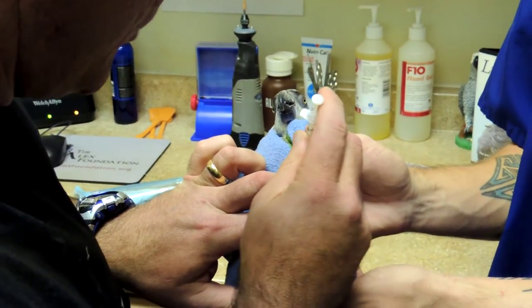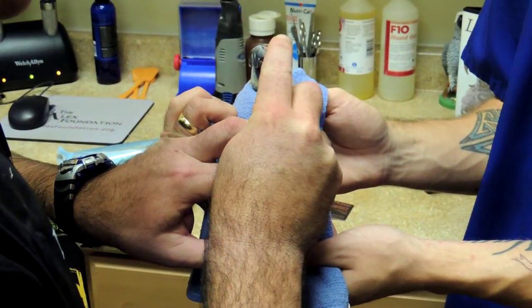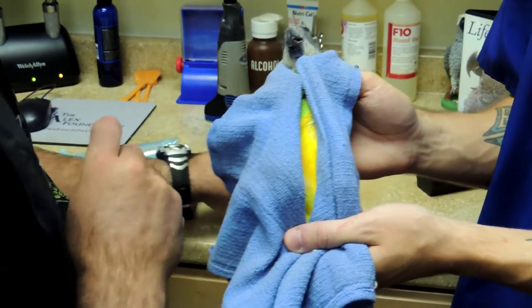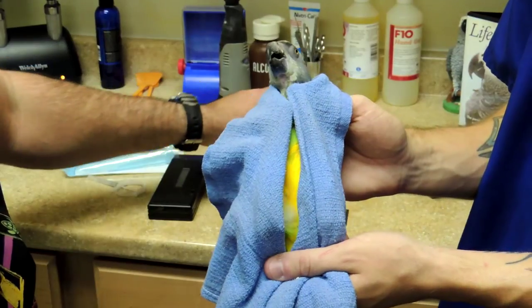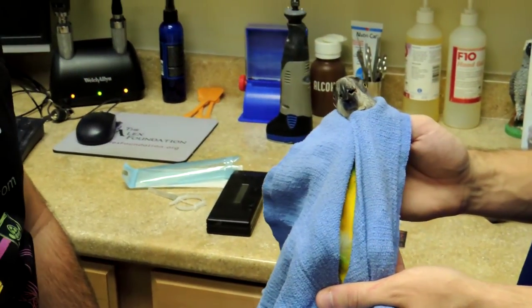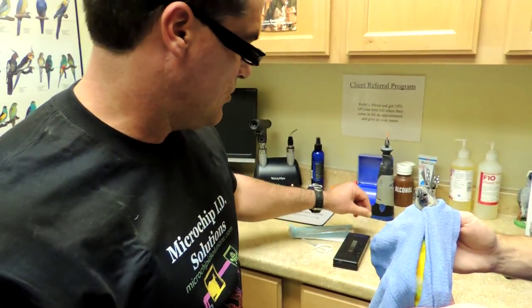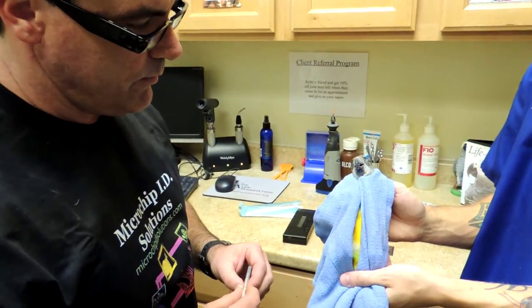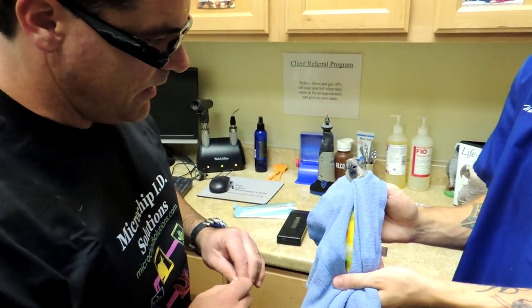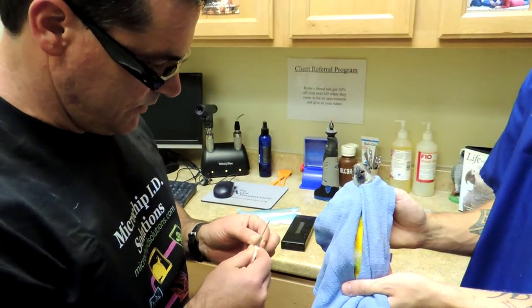Then we'll follow in with the Microchip ID Solutions chip and trace that same path. The benefit of this particular microchip is its small size and the lack of need for general anesthesia to accomplish the same task. So it's much less muscle trauma, much less pain post-injection — and that's our goal.